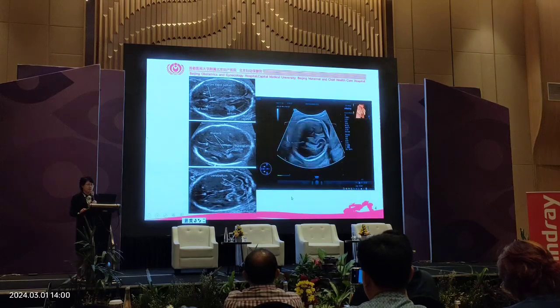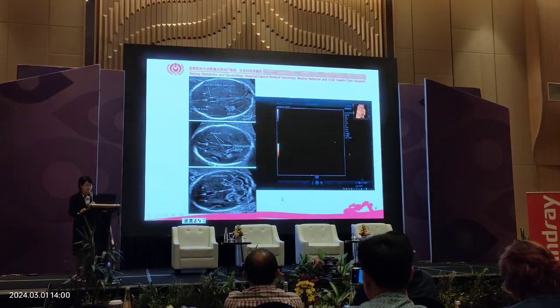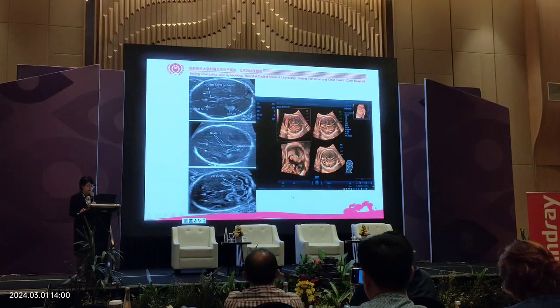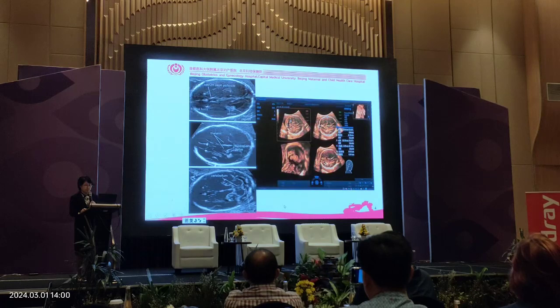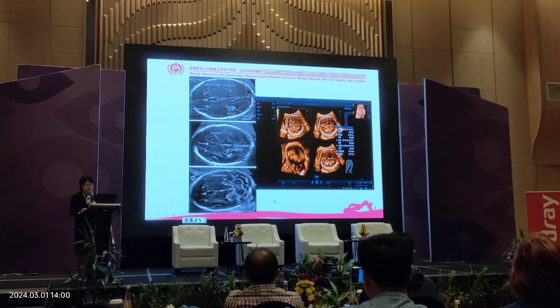You can get the 3 sections and get the measurements automatically and quickly. Wait a moment. So it's very easy to get the 3 sections.